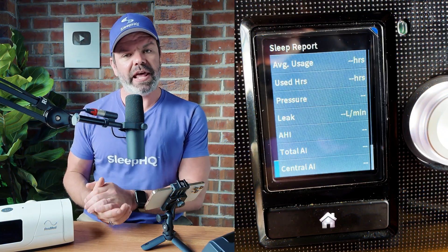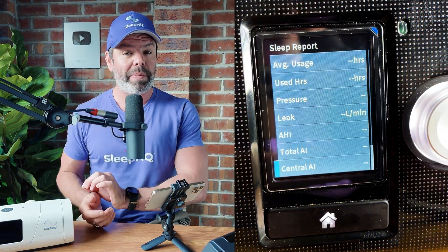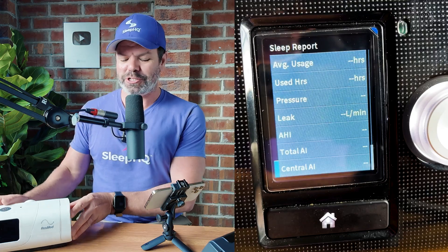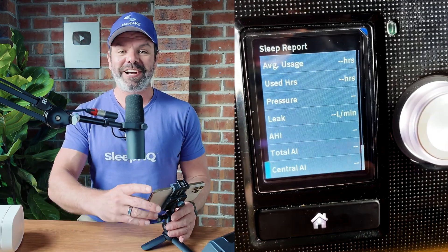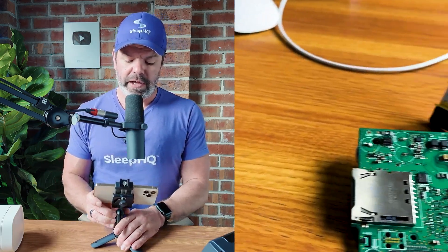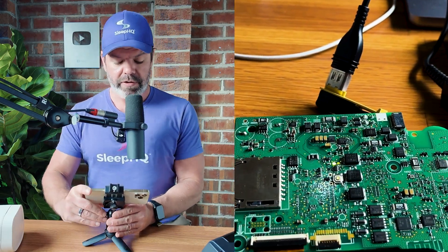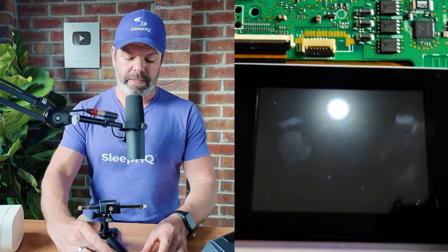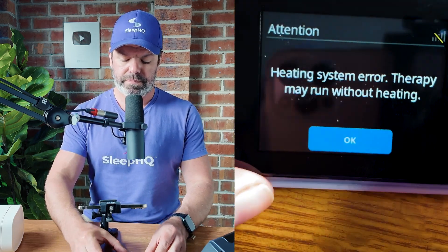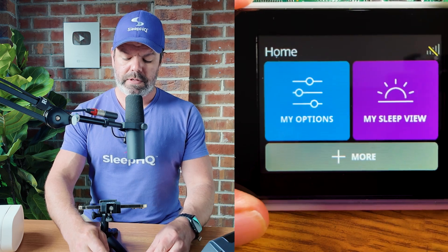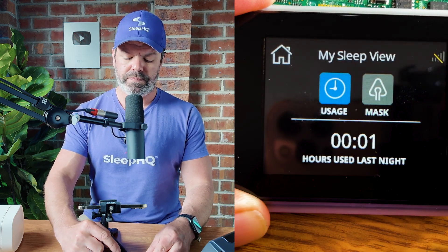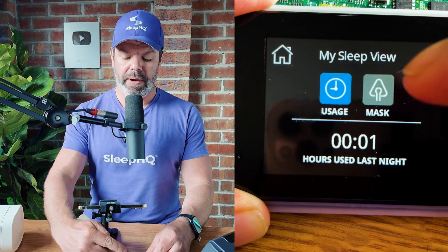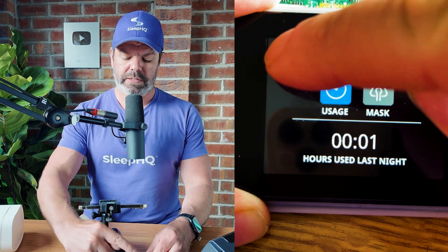Now we can do the same thing on the AirSense 11, however accessing that secret menu is a little different. I'm going to show you on my deconstructed AirSense 11 because I've been messing around with it and can't be bothered putting it back together. Right now if I check my sleep view, you can see once again I've got usage and mask. We'll go back to home.